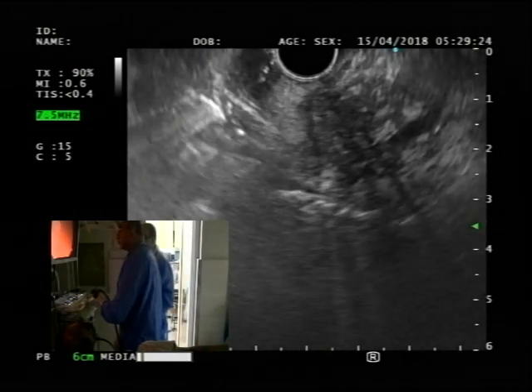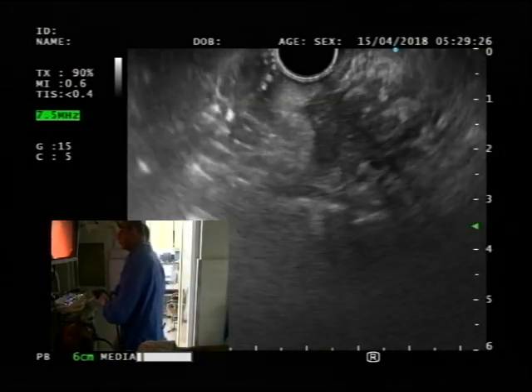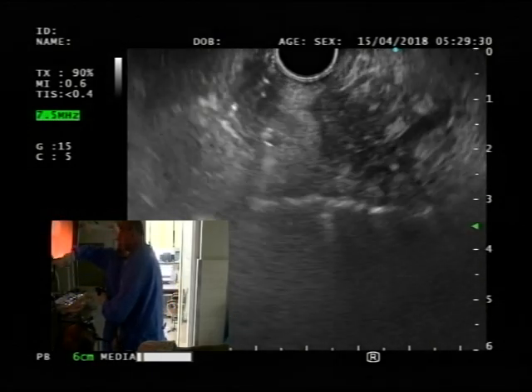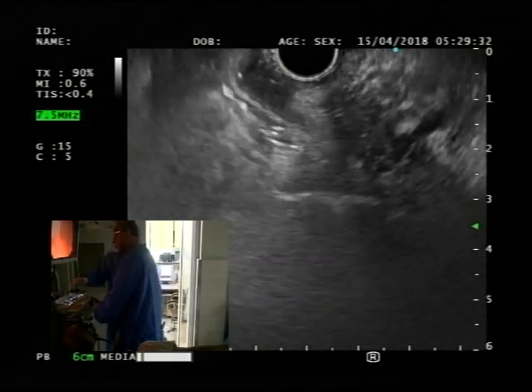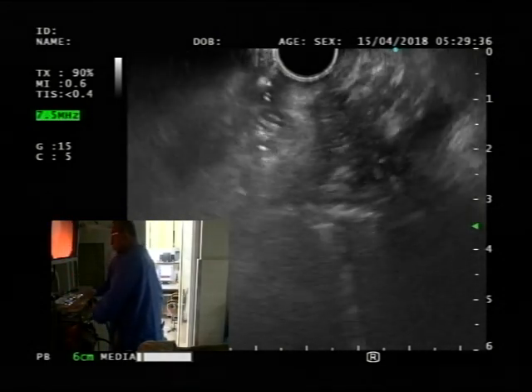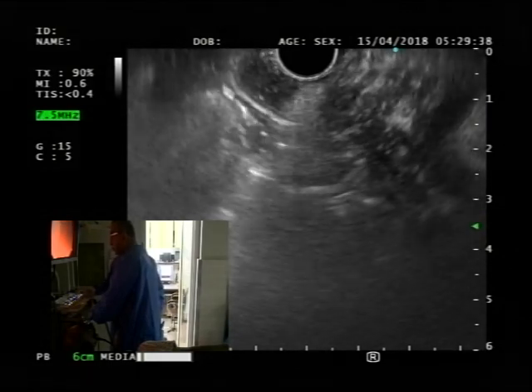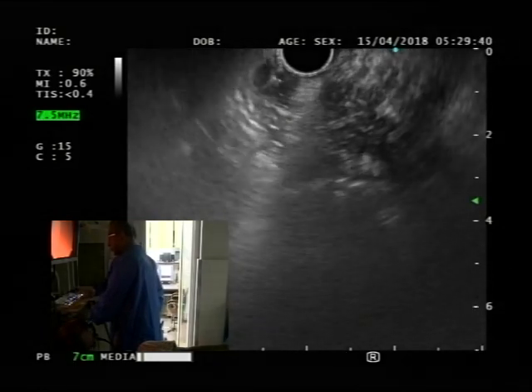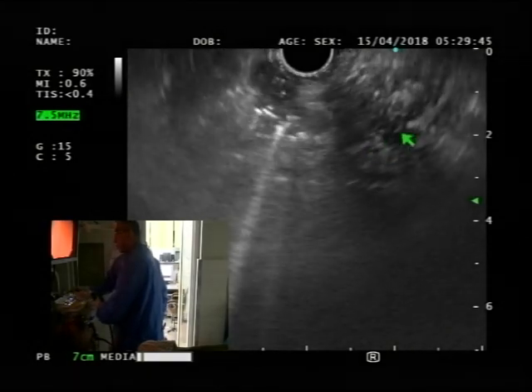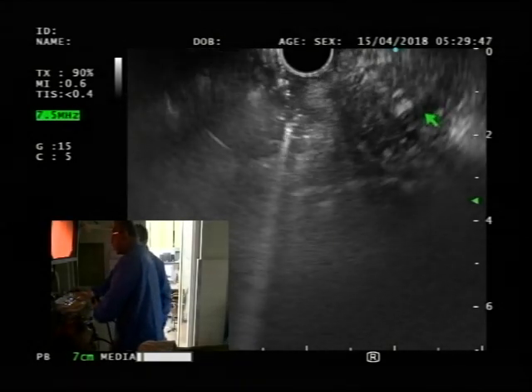Good. So you have that there. And I just want you to practice this spinning back. Generally speaking, the counter is towards the bile duct, and if you go clockwise, it's towards the pancreas. So this structure to the right, which is anechoic, is your dilated pancreatic duct, which is this. Oh, I see, right. This here.